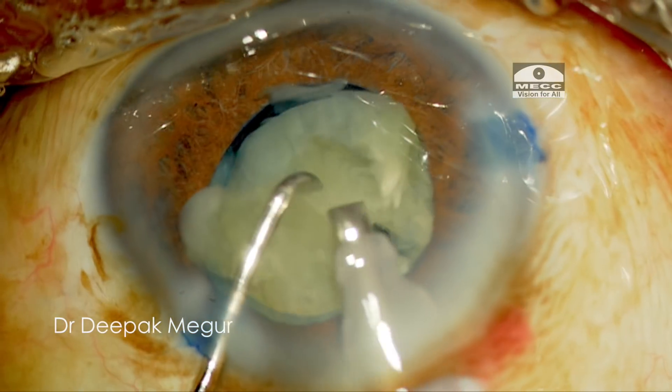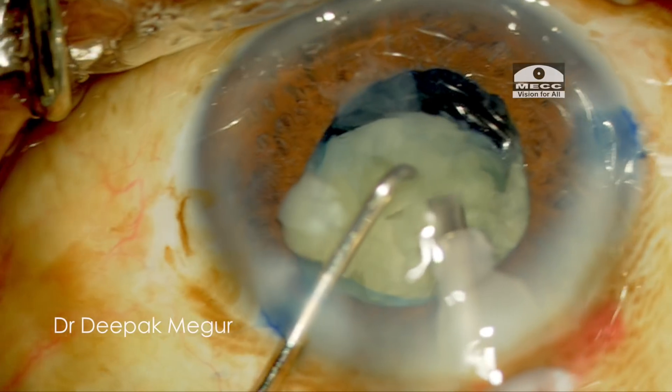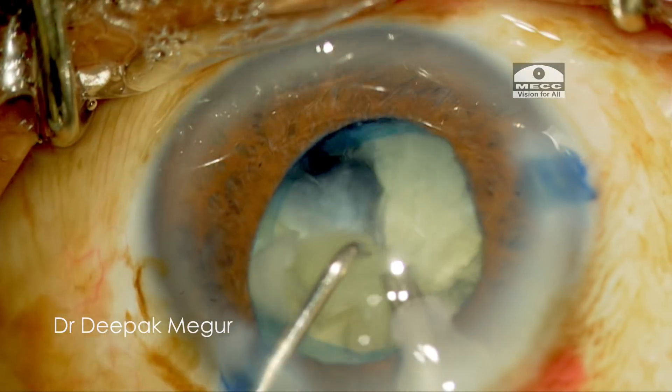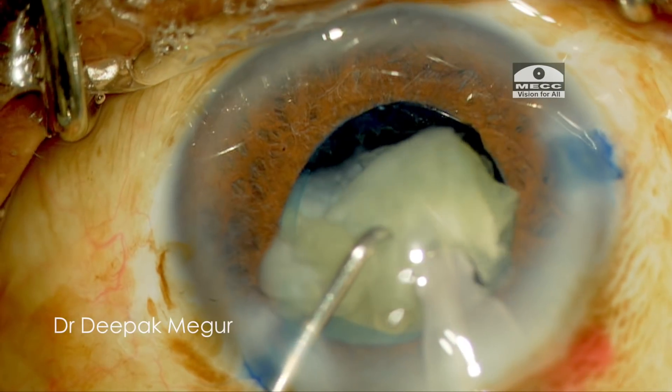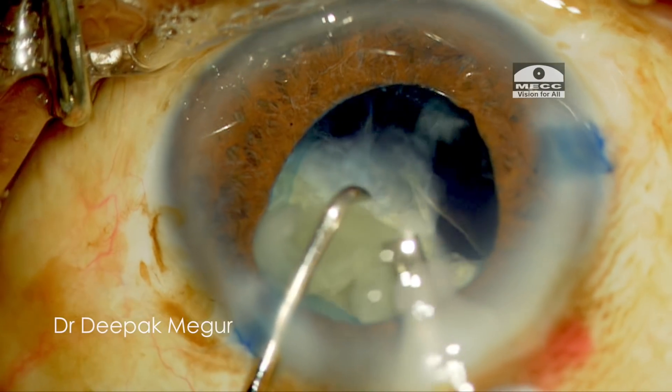Once we have all the fragments chopped, now is the time to emulsify each of them. I hold each fragment into the pupillary plane and then emulsify using the appropriate phaco power.